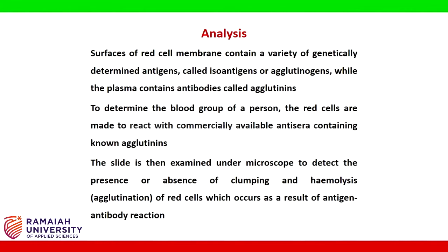The slide is then examined under microscope to detect the presence or absence of clumping and hemolysis of red cells, which occurs as a result of antigen antibody reaction.